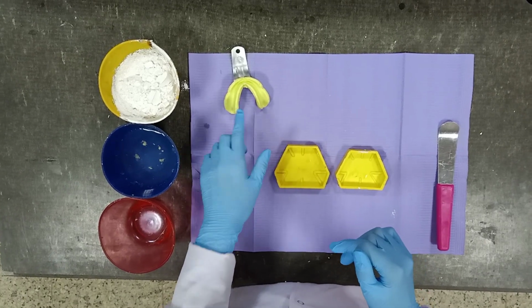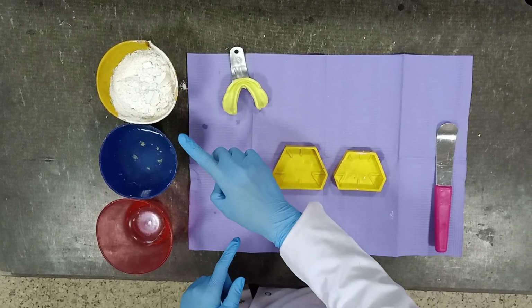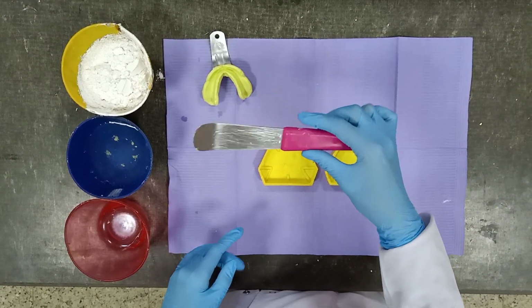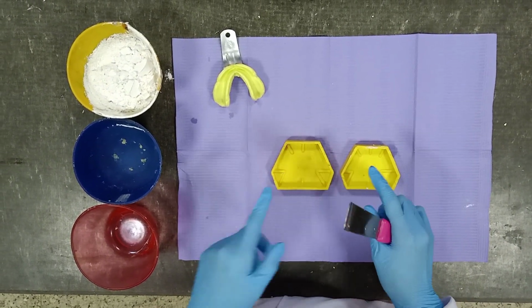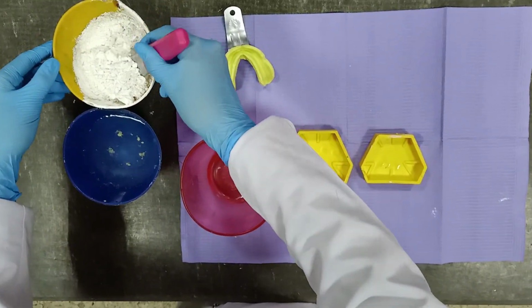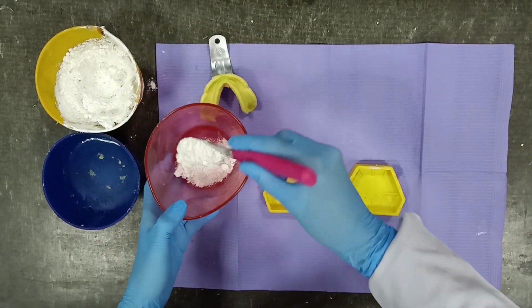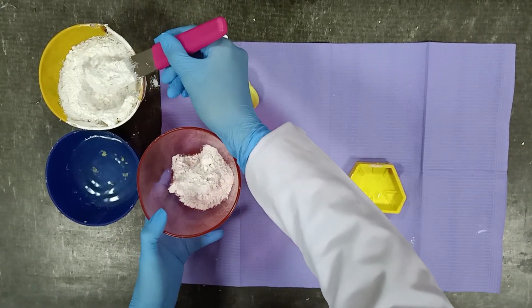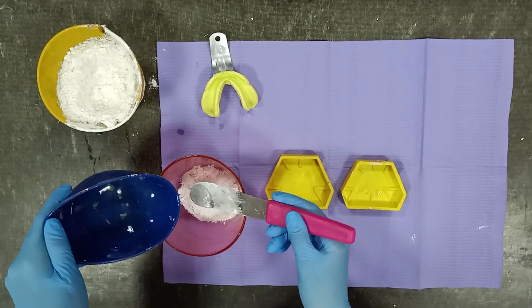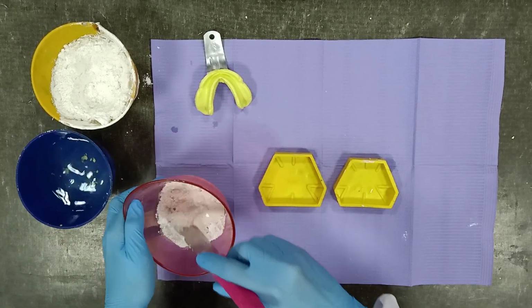Now for the pouring part. To pour the impression, you need plaster of Paris, water, and a rubber bowl and spatula for mixing. We have a base former to make the base of the cast. Now let's mix the plaster of Paris. We are going to use what's called double pouring technique. First we need a creamy mix to get all the details of the primary impression.